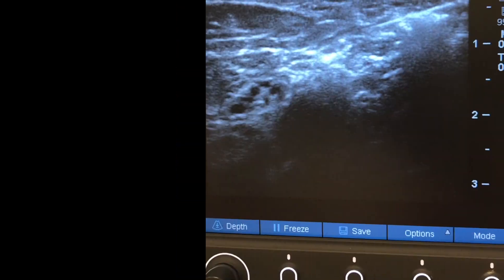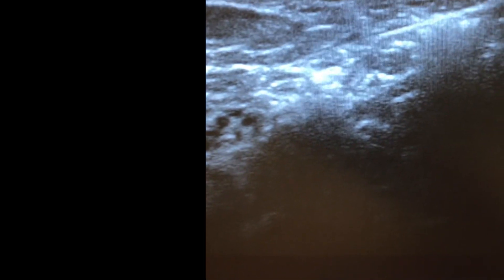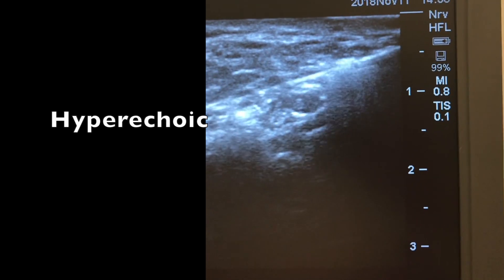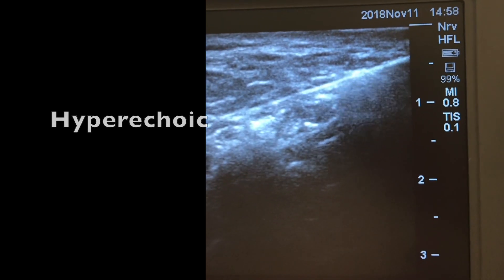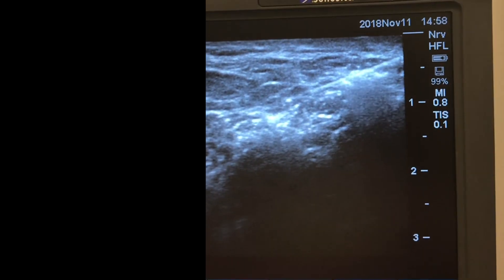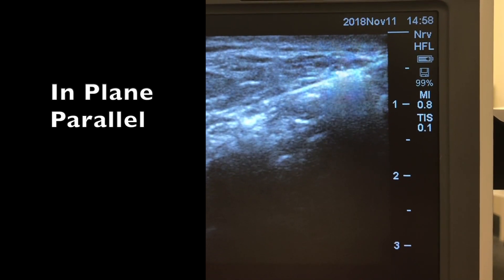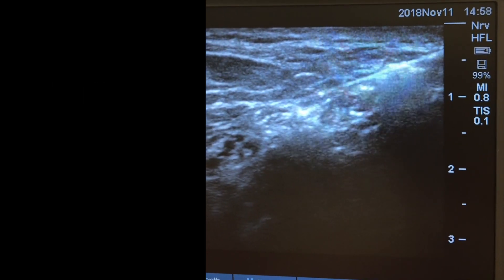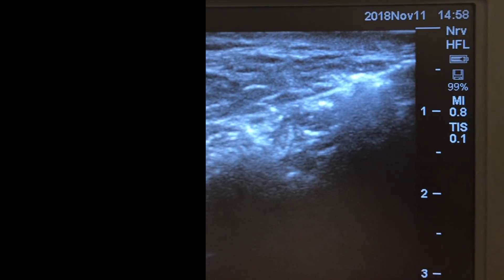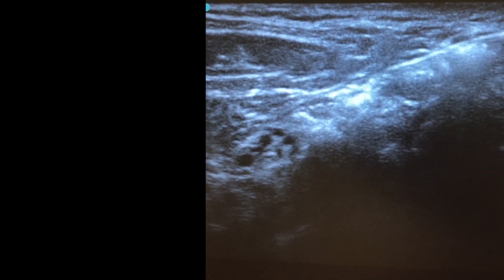This is the view you want for an interscalene block. On the cadaver, the brachial plexus is on the left and there's a needle advancing toward it. That white line is called hyperechoic — more solid structures appear whiter on ultrasound. This is a difficult view to get with the needle in-plane, meaning parallel to the probe, since the probe sends out a scan about the width of a credit card slice. She achieved a good view to advance toward the brachial plexus and deliver local anesthetic.